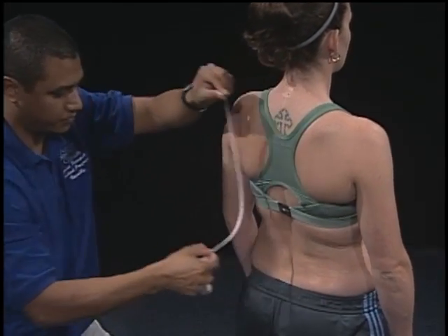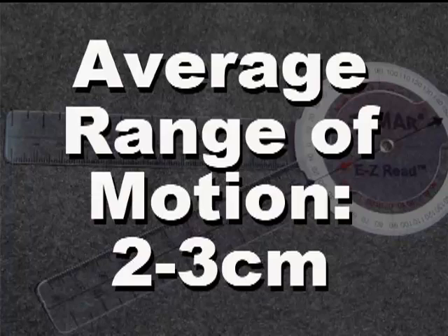If necessary, assist the patient to the standing position. Average range of motion is 2 to 3 centimeters.